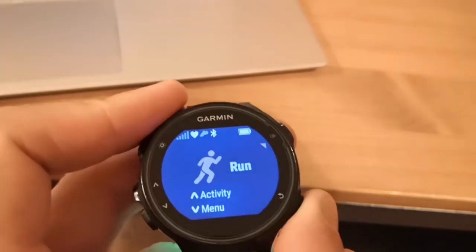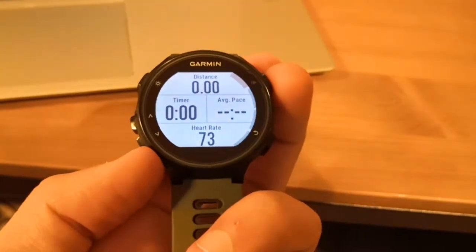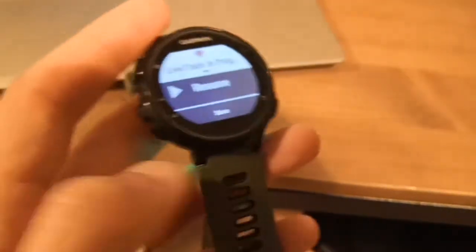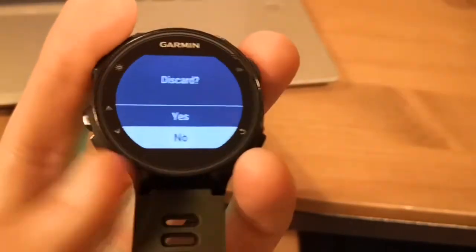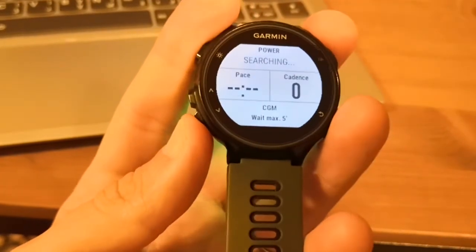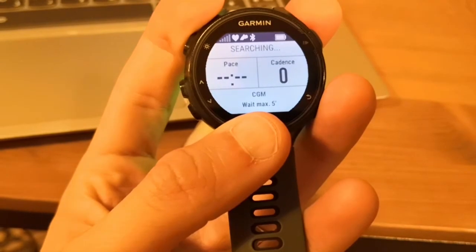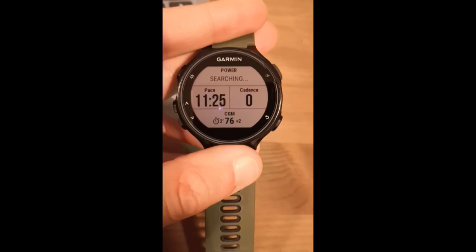If I then go back out and press to start the run, and go down to screen two, it's worth noting the CGM will wait a maximum of five minutes — it only takes a reading once every five minutes. So when you start your run, sometimes it won't have taken a reading quickly enough. But you can see it's now coming up with my actual live reading. Five minutes is the longest you need to wait.